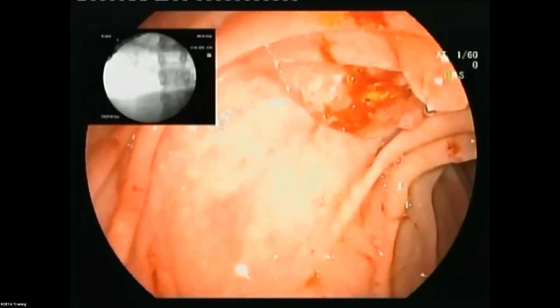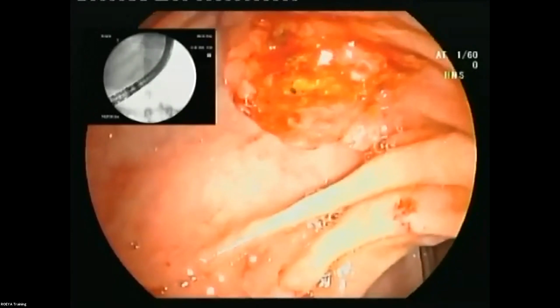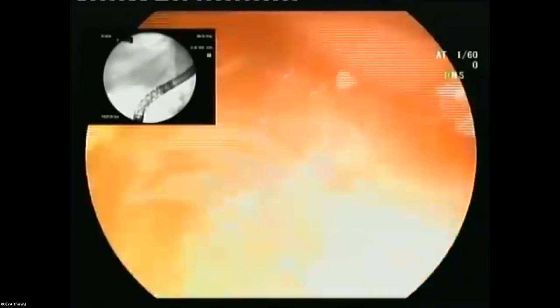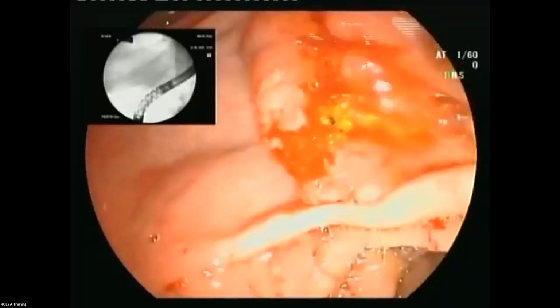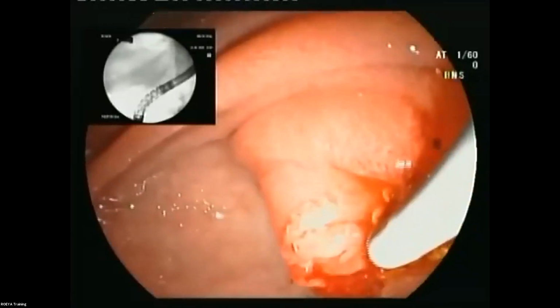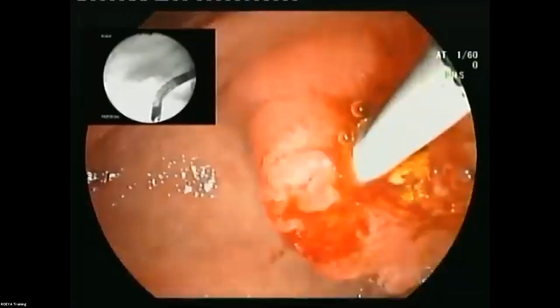But Hani, I do prefer to wash the common bile duct with saline before injecting contrast, to avoid any debris going inside the intrahepatic radicals, to be sure that there is no debris or small stones or granules. Exactly what I do, Dr. Khalid. I cannulate and remove the guide wire, because the working channel of the guide wire is bigger than the working channel of the contrast inside the balloon.